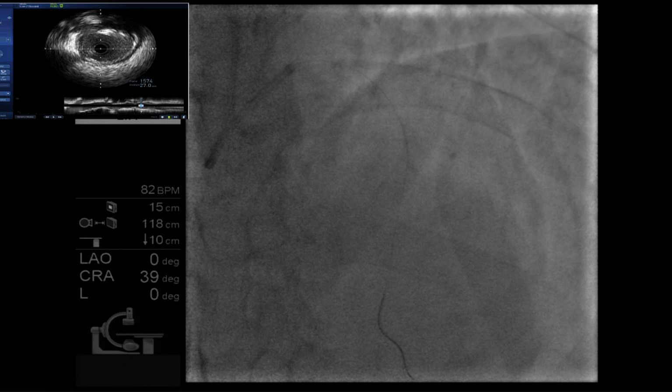My opinion, I'm doing IVUS now. My IVUS, I think, is pretty good. I get very good information. But I think OCT will give the same information too. The winner, we don't know until we have some double-blind study. But at this moment, I don't think IVUS is inferior to OCT.